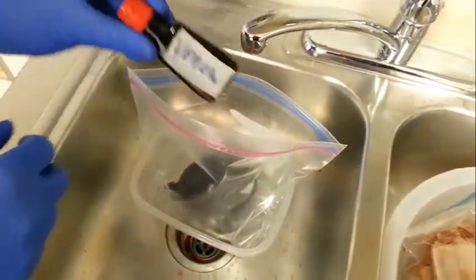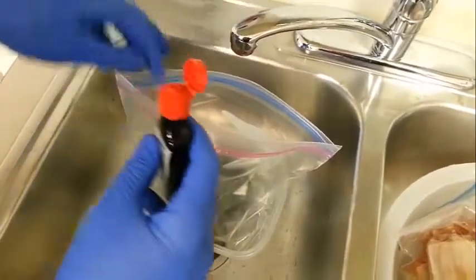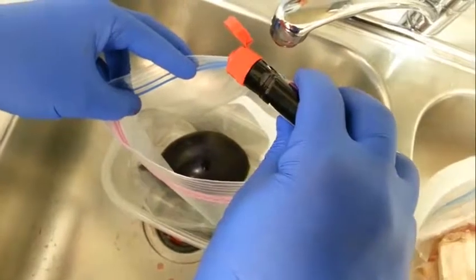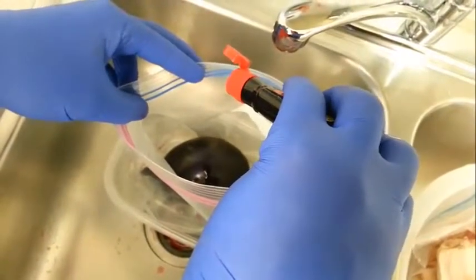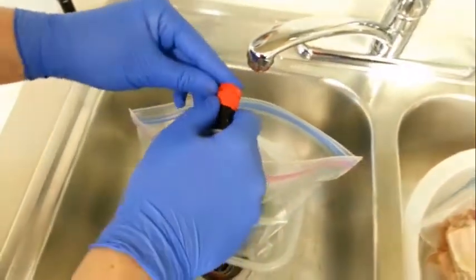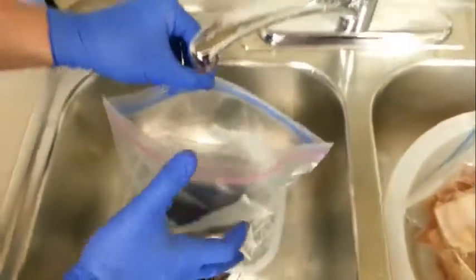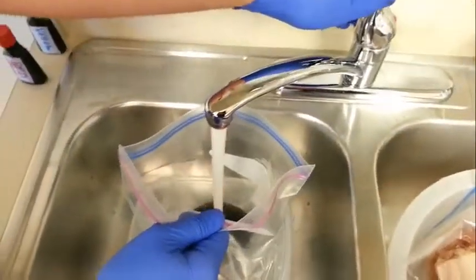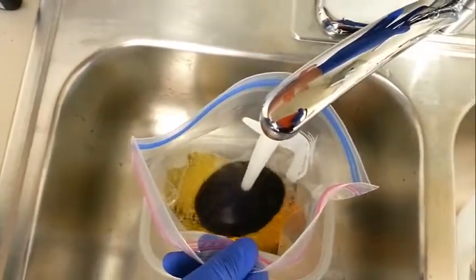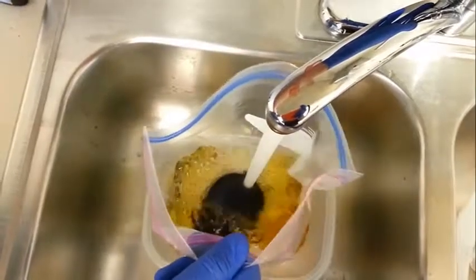Take your yellow food coloring — anywhere from five to ten drops, depending upon how yellow you'd like it. For the purposes of the film, I'm going to make it extra yellow. Then add water. You almost want to overfill the balloon so it gives you a little bit of extra spillage to get rid of the air bubbles that will collect in the bag.